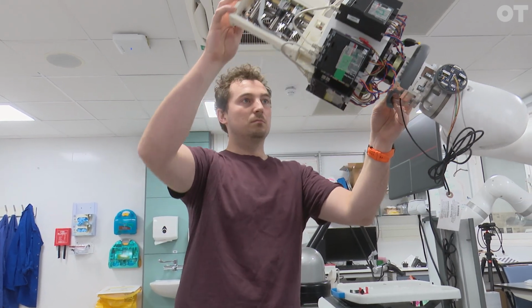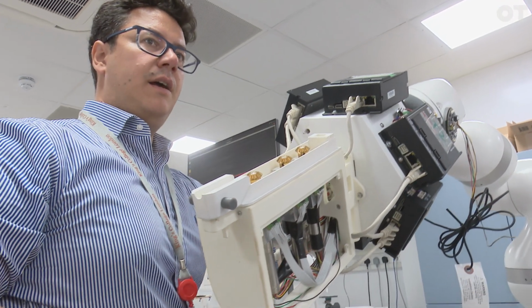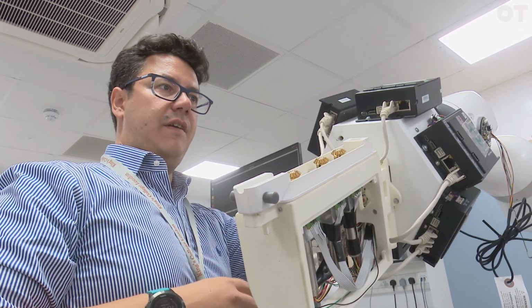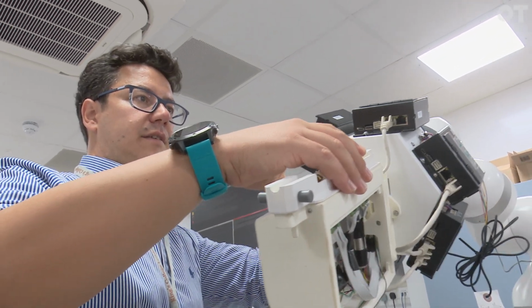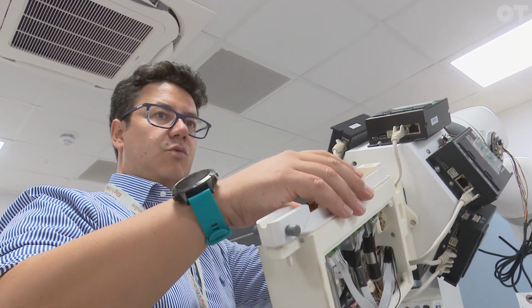So a lot of the algorithms that we're trying to make have to do with how do you make these motions smoother, because this is a big robot, actually, it's very heavy. And to be able to move it like this in a semi-transparent fashion has a lot of other problems to solve under the hood.